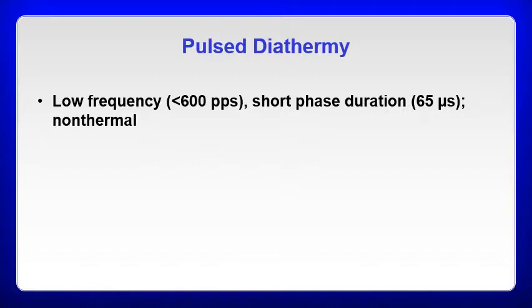If you want just pain reduction, reduction in muscle spasm and chronic inflammation, again, 400 to 800 pulses per second and 200 to 400 microseconds. And if you're looking for vigorous heating, so your 4 degree increase for stretching and mobilization, you're going to want to do at least 400 microseconds and 800 pulses per second.